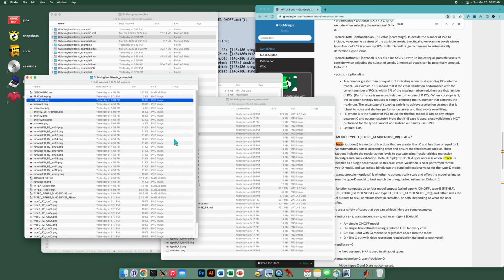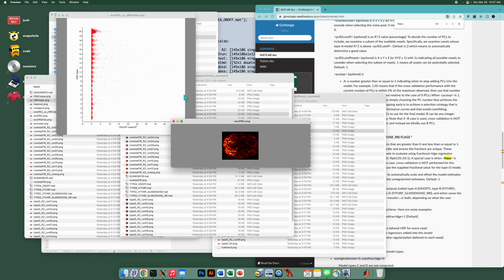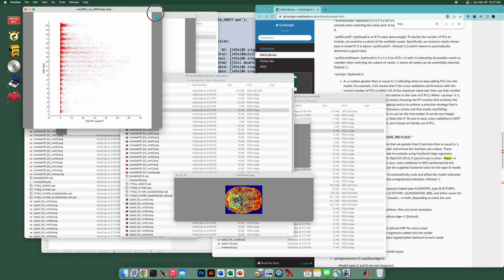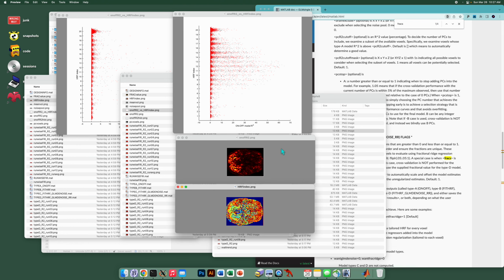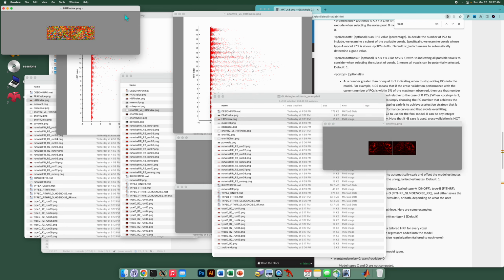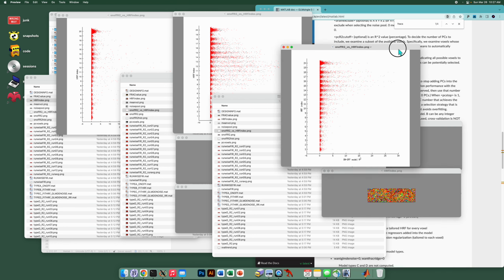All right, for comparison, let's do this for example 2. So we have the on-off r². We have the HRF index. Here we already noticed by eye the signal, the HRF index was structured, and here's the quantitative plot. And then finally, we have the on-off r², the selected HRF index, and the scatter plot.